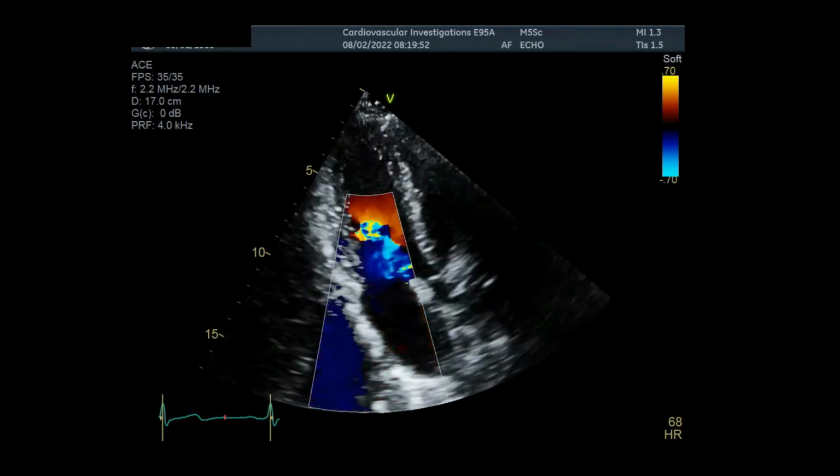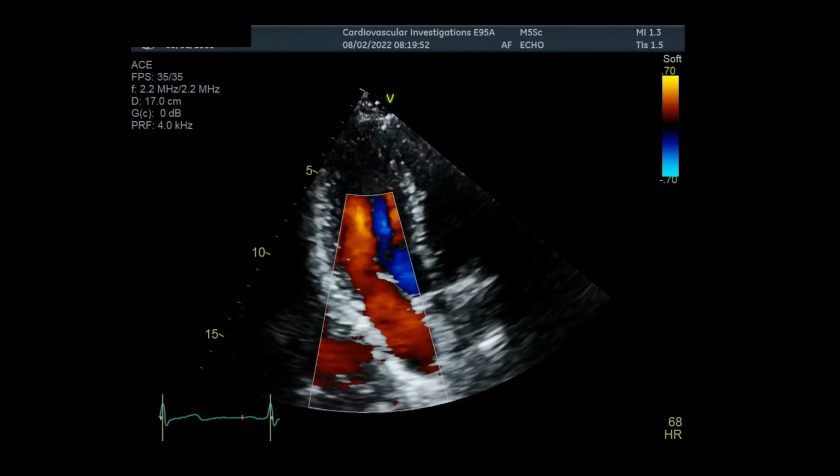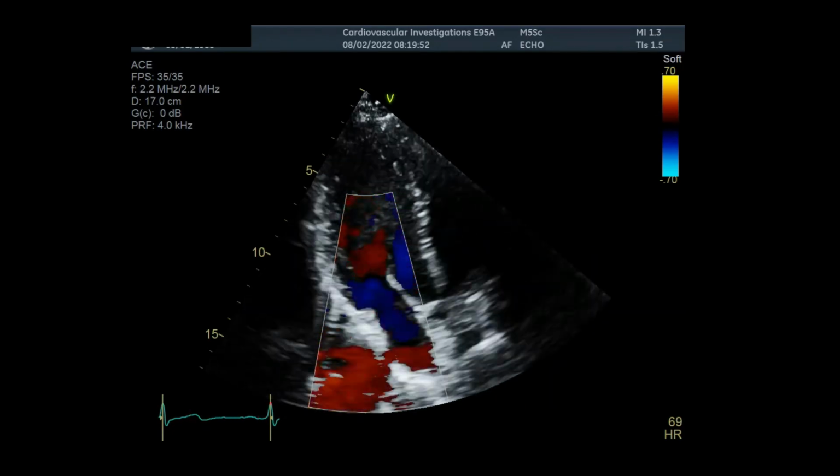Of course, an echo would also include subcostal views right at the end. I haven't included those in this talk. So that completes the presentation on assessment of a normal mitral valve.